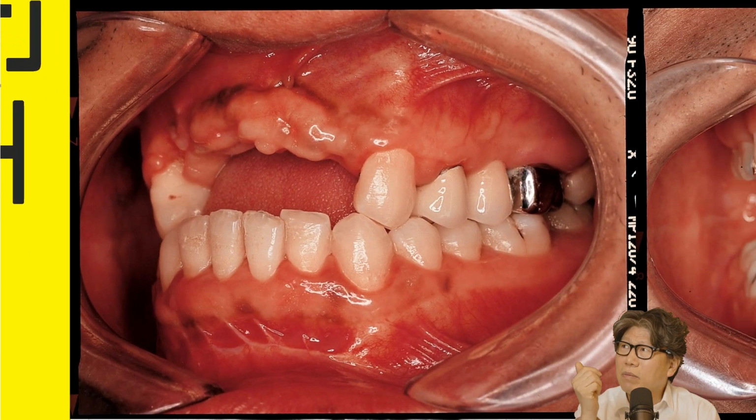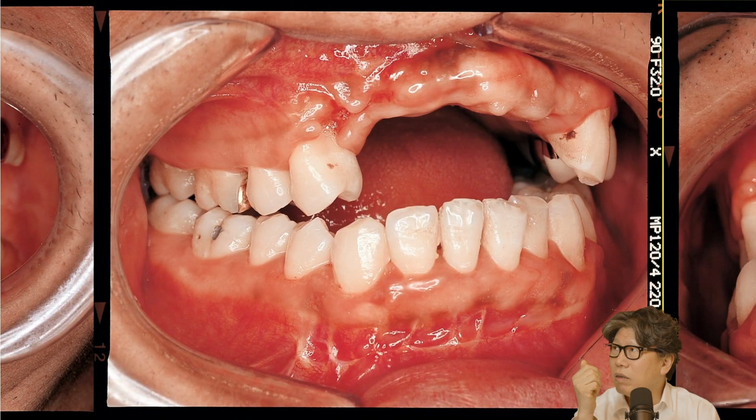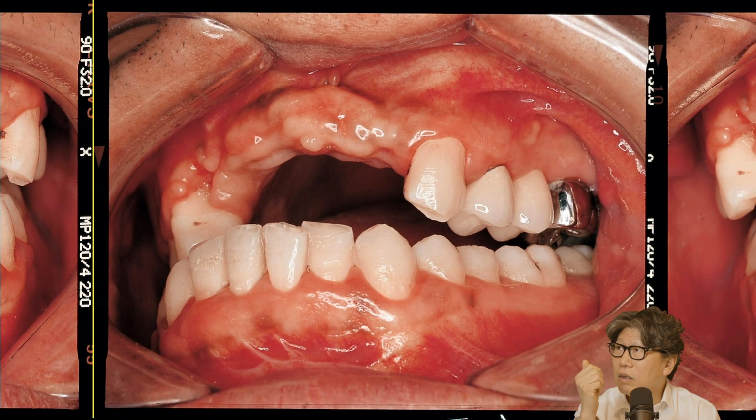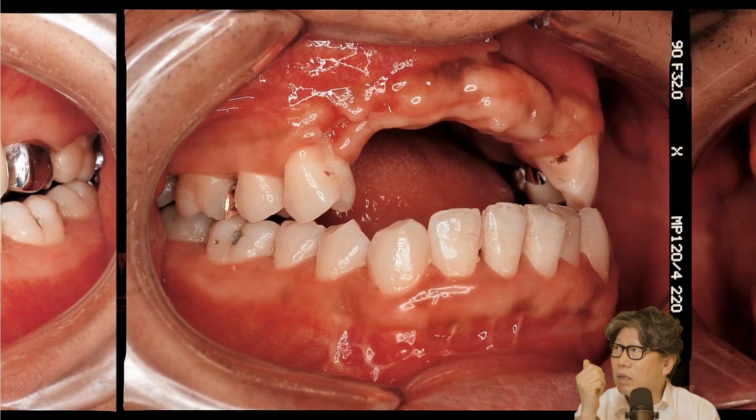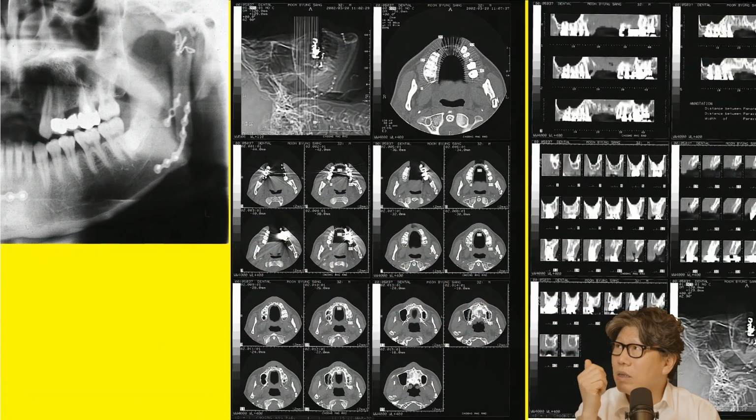Because we get a lot of difficult patients, and here's a patient who lost all of his anterior premaxilla because of trauma. So there are quite a few cases like this. So there's nothing you can do. Now, we used a DO machine from the Martin company. We didn't have cone beam CT, CBCT, at that time, so I think we used this medical CT.